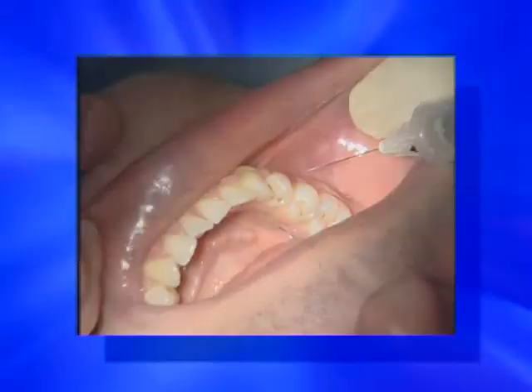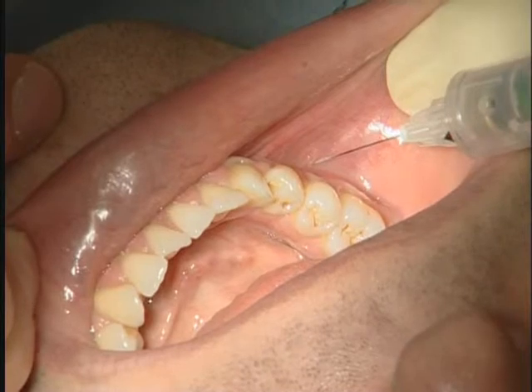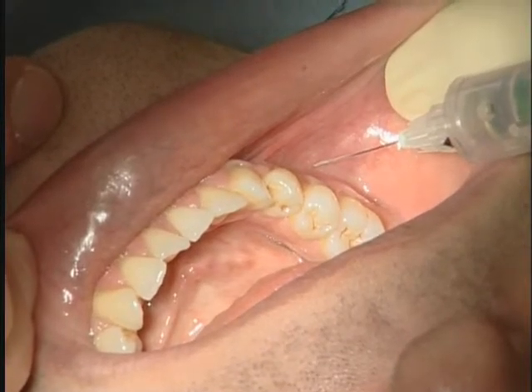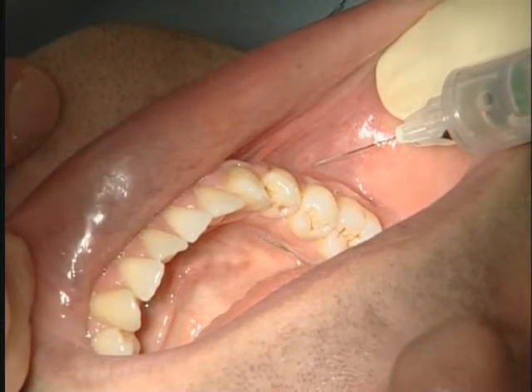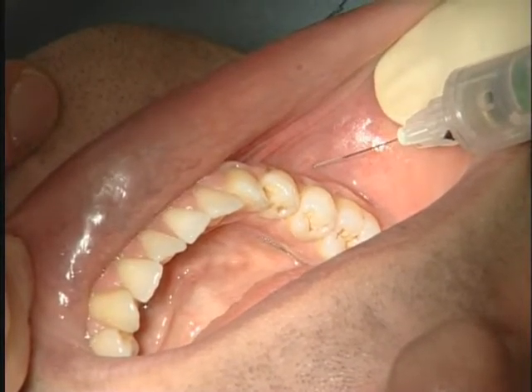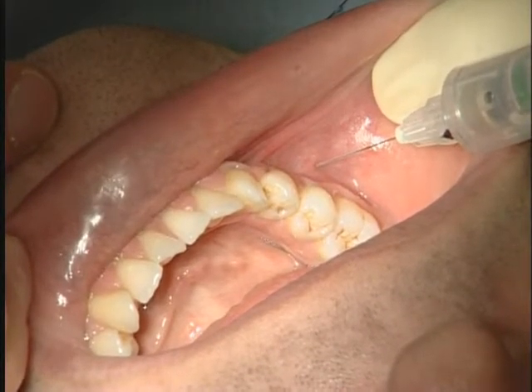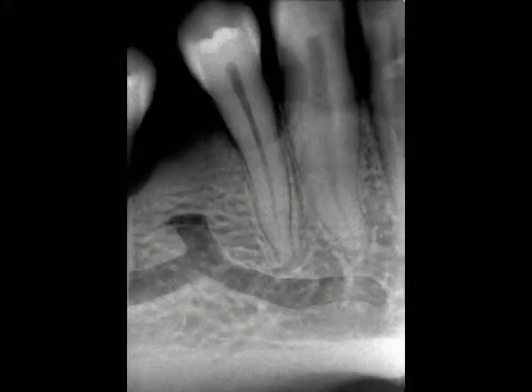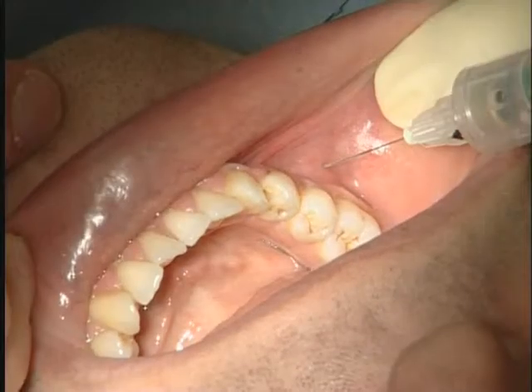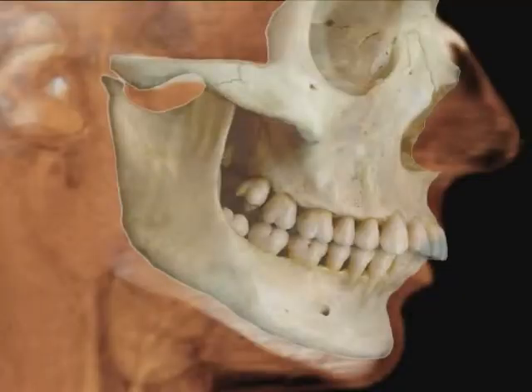There are few indications for anesthesia of the mental foramen, but it may be the best technique to use when dealing with the first premolar. It is actually an intraosseous anesthesia technique which uses a natural orifice as the diffusion route. As the position of the foramen can vary considerably, a retroalveolar X-ray remains the best process to pinpoint its location. It is not a recommended technique, as if the needle penetrates the mental orifice, you risk damaging the neurovascular bundle.